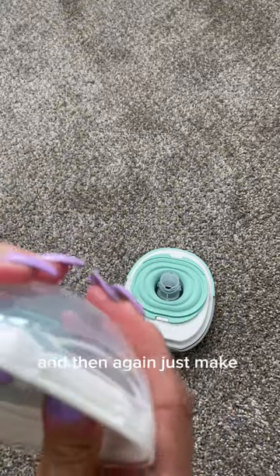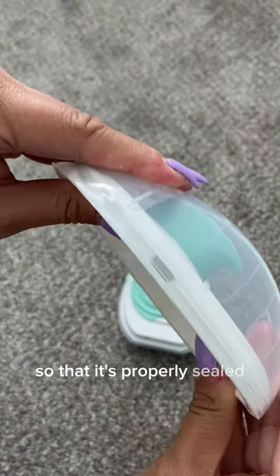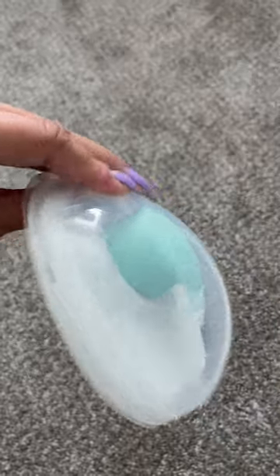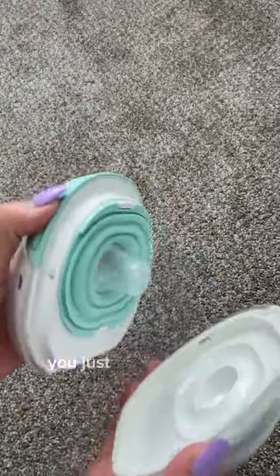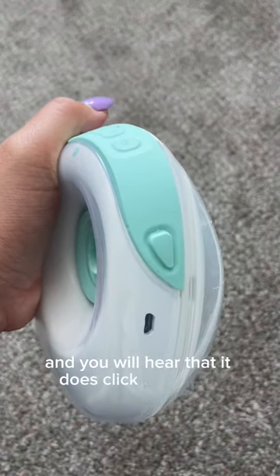Just make sure that it goes in properly so that it's properly sealed and you're not going to have any leakage. Then after that's done, you just put the pieces together and you will hear that it clicks into place.